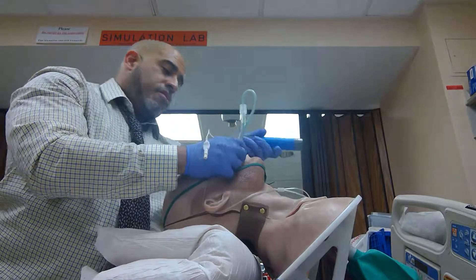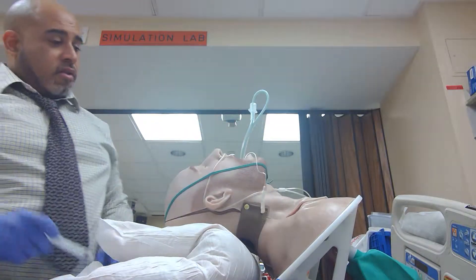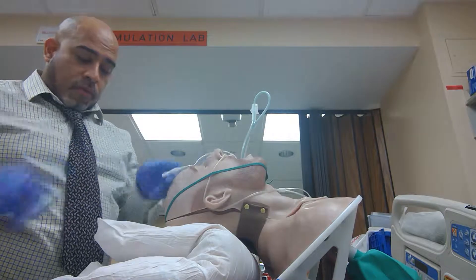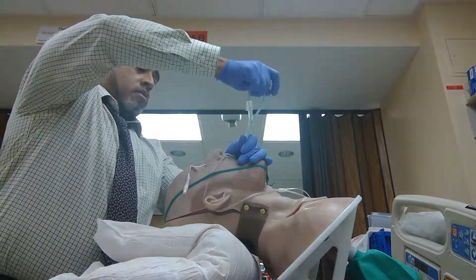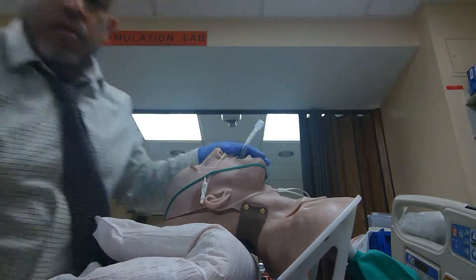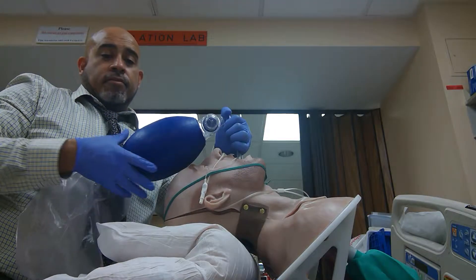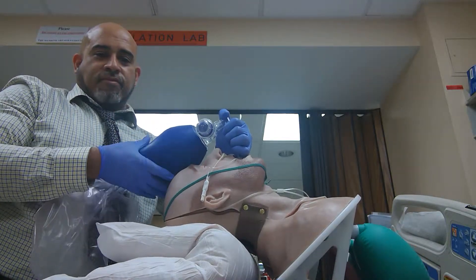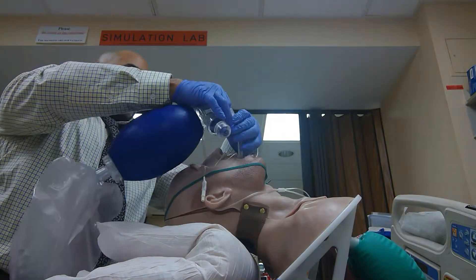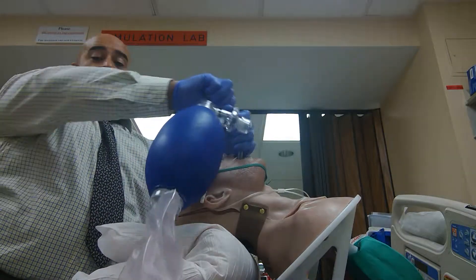Wait — look down at the 23 mark, play with the syringe. Back up. Success.